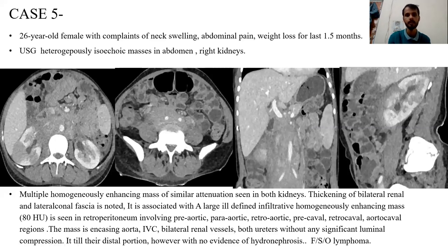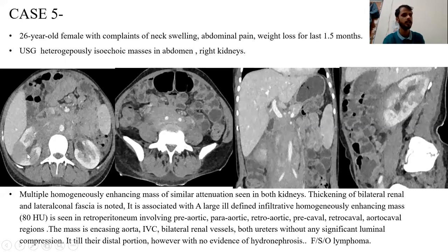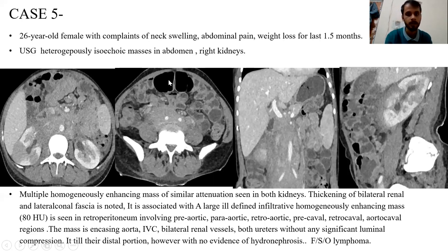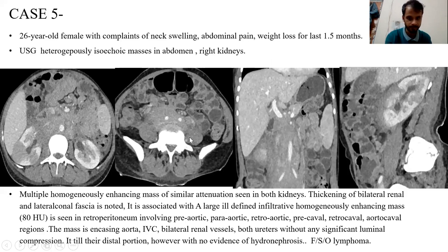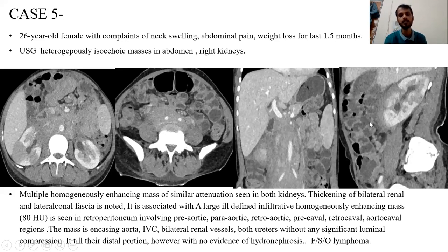Case 5: A 26-year-old female with neck swelling, abdominal pain, and weight loss for the last one and a half months, with heterogeneous isoechoic masses in the abdomen, peritoneum, and right kidney on ultrasound. CT shows a heterogeneous enhancing mass within the right kidney, with similar masses in the peritoneum and retroperitoneal region. The mass is seen encasing the IVC and aorta and occupying most of the abdomen. Multiple heterogeneous enhancing lymph nodes are seen in the peritoneum and retroperitoneum. Cervical lymph nodes were also involved. This is a case of disseminated lymphoma involving the kidney.